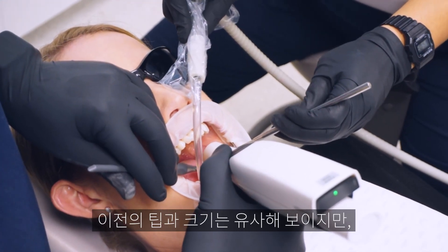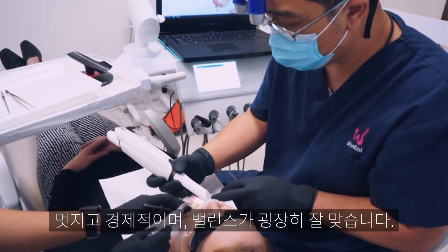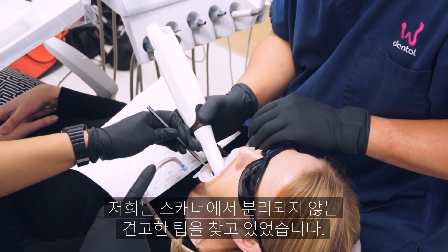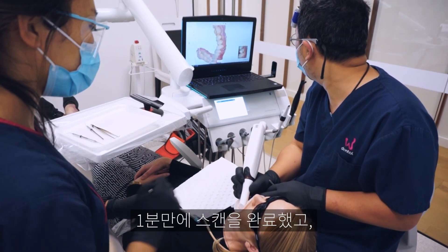It seems to be a similar size to the previous one — nice and ergonomic, pretty well balanced. I really like the new tip, it's nice and firm. The battery life seems to be better as well.